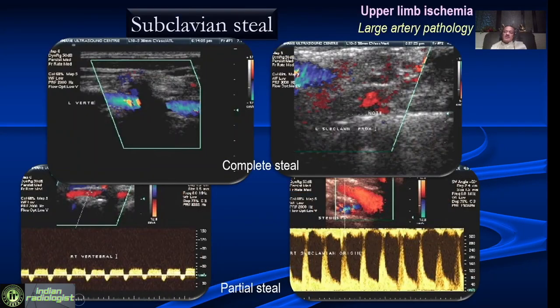We look at the vertebral first to pick up subclavian steal, because once you have subclavian steal, the diagnosis is simple and the examination is over in about two minutes. For example, here we have a patient with a complete steal on the left side where the vertebral artery shows retrograde flow in blue, and there is an occlusion of the subclavian artery. On the right side there is a partial steal — a typical alternating waveform — and the patient has a stenosis at the origin of the subclavian artery.